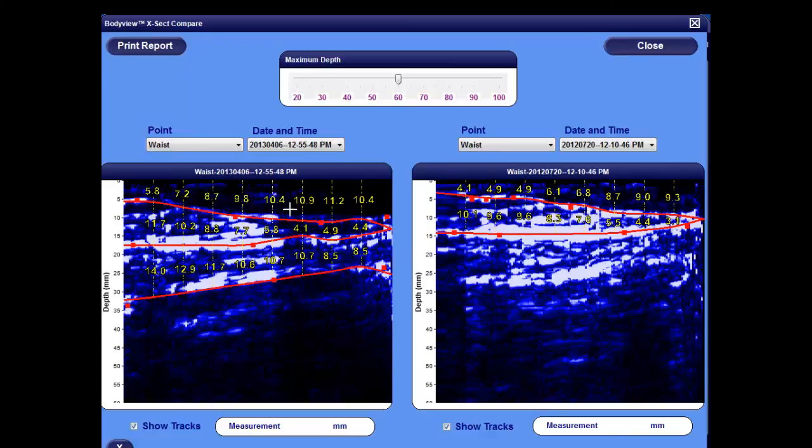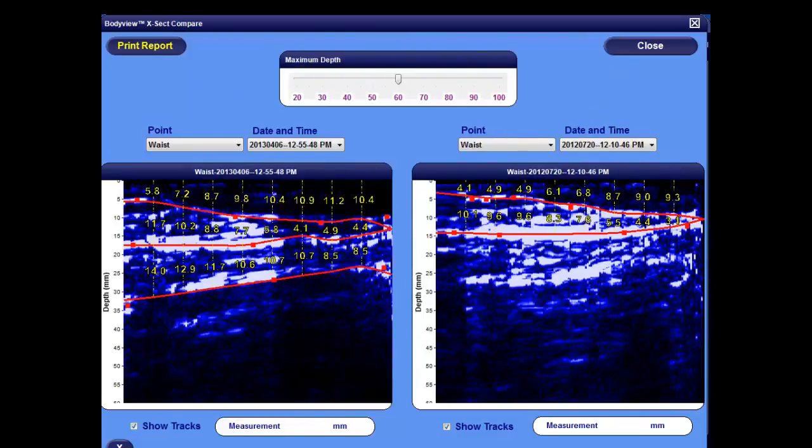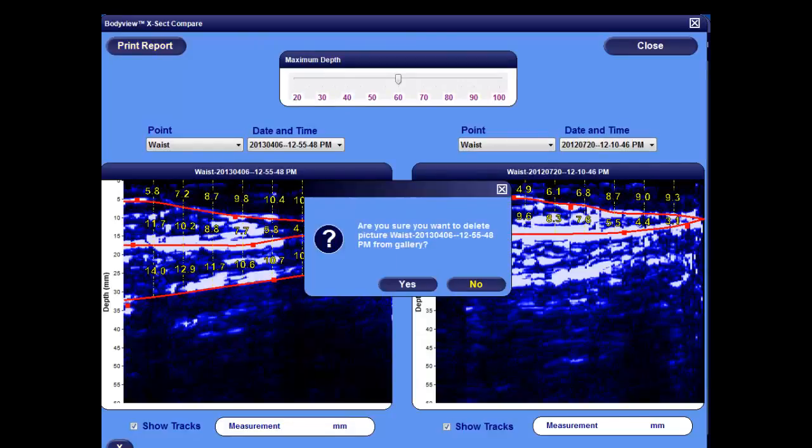Selecting the Print Report button at the top left of the screen gives you the options to print the report, save it to a file, or email it directly to your client. Selecting the X at the bottom left of the screen gives you the ability to delete images from the gallery if you wish. You can do this by selecting Yes or No.